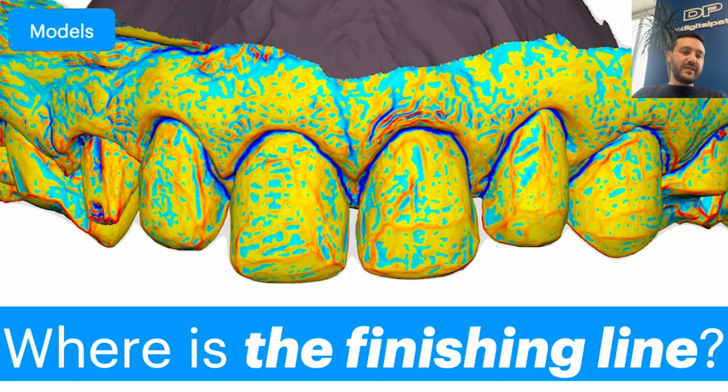But the other question is, where is the finishing line? In veneer cases, margin clarity is everything, and Medit Design helps us to see it clearly. By applying a simple filter inside the software, after placing retraction cords, we can highlight the end of our preparations with high contrast. In this case, the margin shows up in blue, precisely marking where the veneer will end.